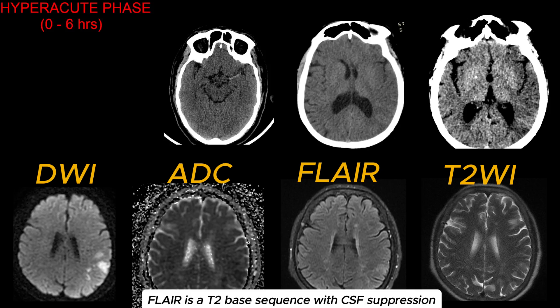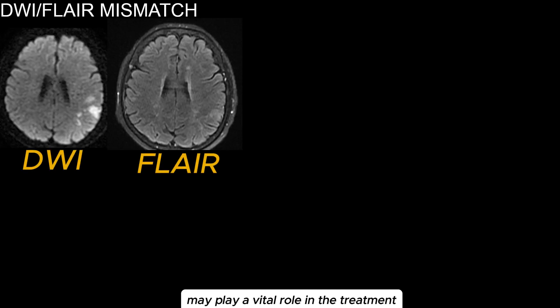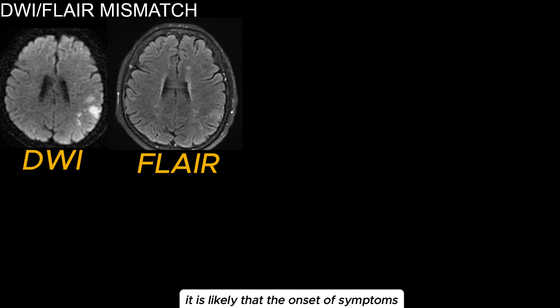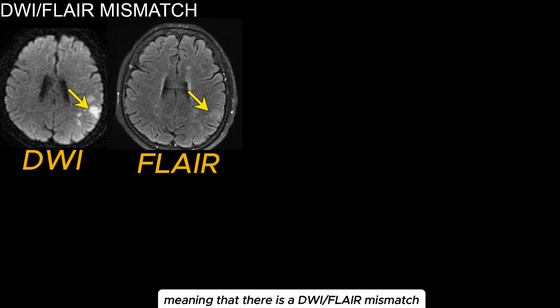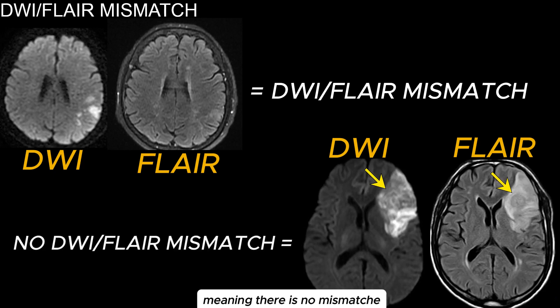FLAIR is a T2-based sequence with CSF suppression and therefore is not affected by the partial volume effect from the CSF. These FLAIR changes may play a vital role in treatment, as the DWI-FLAIR mismatch can be used to estimate viable brain tissue. The majority of patients will have FLAIR changes after 6 hours, so if the FLAIR changes do not match the DWI, it is likely that the onset of symptoms is within the last 6 hours. Here the changes are much more prominent on the DWI compared to FLAIR, meaning there is a DWI-FLAIR mismatch. Compare it to this patient, where the changes on the DWI and FLAIR match perfectly, meaning there is no mismatch.